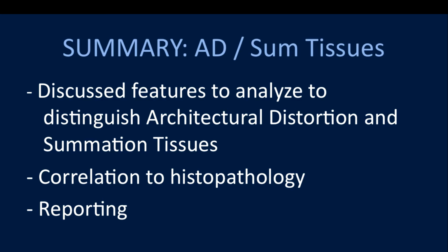Global asymmetries on a baseline exam, do you call them back to examine them, or do you just trust that they are benign? That's a good question. Global asymmetry on a baseline, are they called back? Are they a BI-RADS 0? I would think in our practice they are called back, they're evaluated, we make sure we don't see an ultrasound finding, and that they're not palpable.